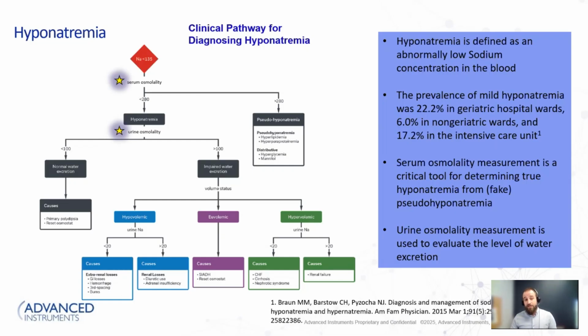So the result of your osmolality test can lead you to decisions that can be the difference in treatment of providing fluid or withholding fluid from your patient. So it's a really important tool at cascading down to how the treatment decisions are going to be carried out for your patients.